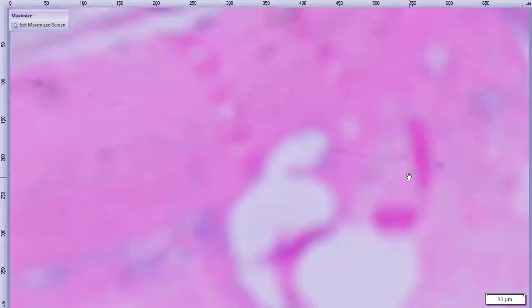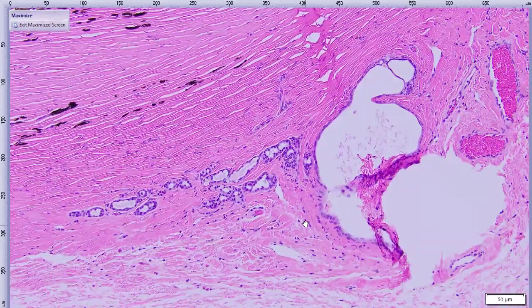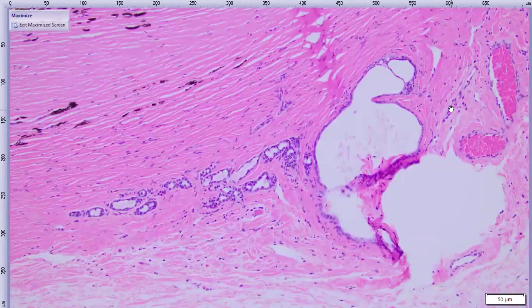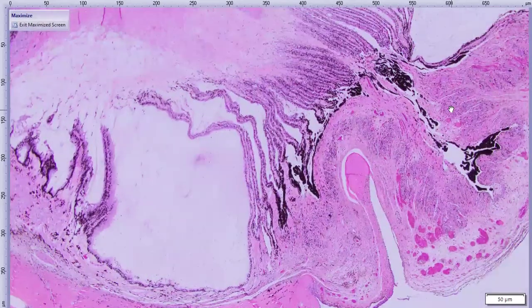If we look close to the limbus on some sides, embedded in the episcleral, or you might call it the subconjunctival tissue, we've got these multifocal tubules of epithelium. And these are conjunctival inclusion cysts, also potentially a consequence of symblepharon, or chronic inflammation at a site. Sometimes it can be ectopic tissue or implanted there iatrogenically. In this case, probably the chronic inflammation and symblepharon angle is why these are here. So we've got that with the cornea.